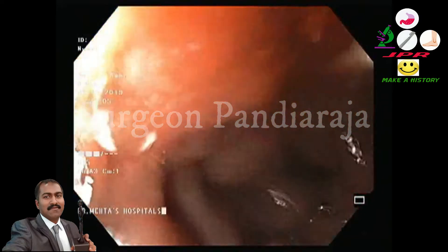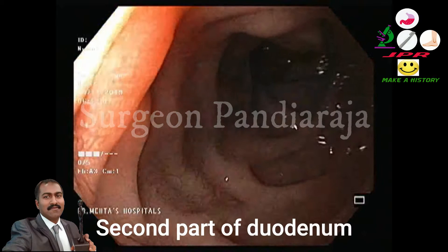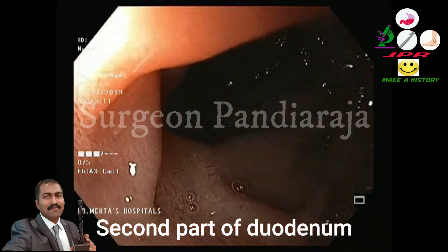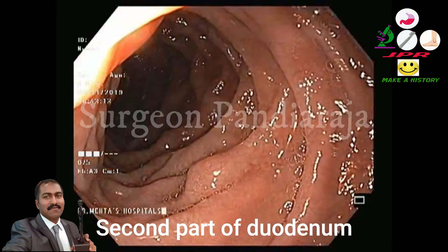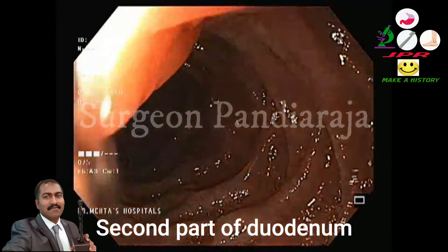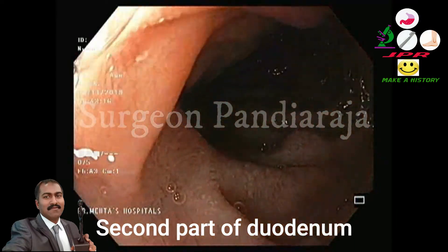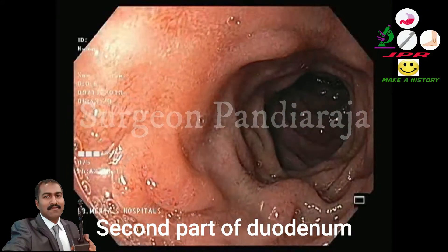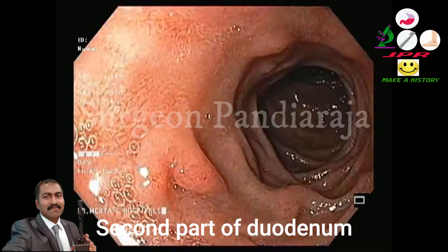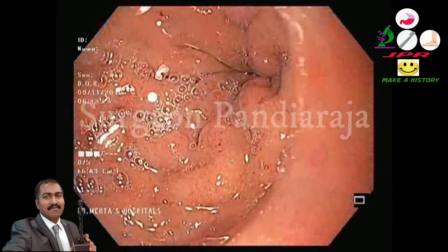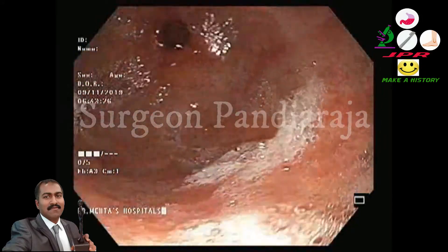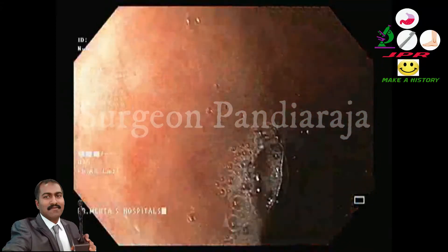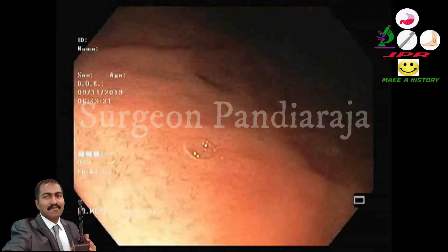Further advancement of the scope into the second part of the duodenum. In the duodenum, we will examine the ampulla as well as the duodenal mucosal pattern. After examination of the second part of the duodenum, the scope is withdrawn. After examination of the body of the stomach, a retroflexion of the scope is performed, followed by examination of the fundus and cardia.